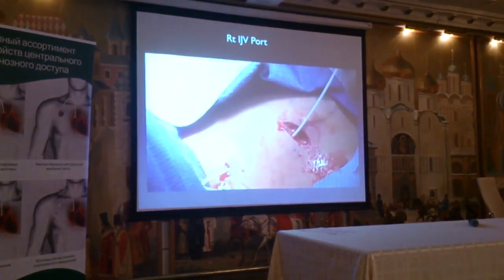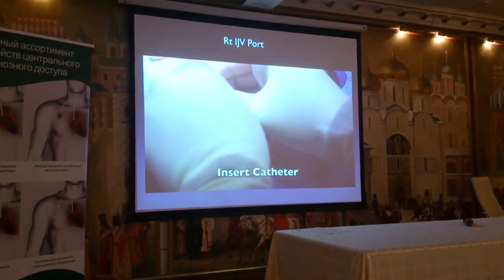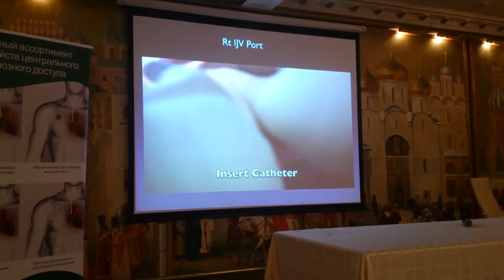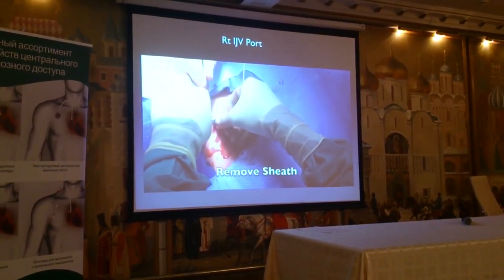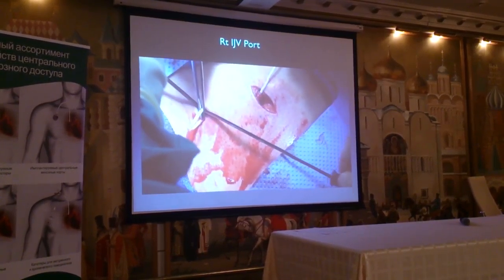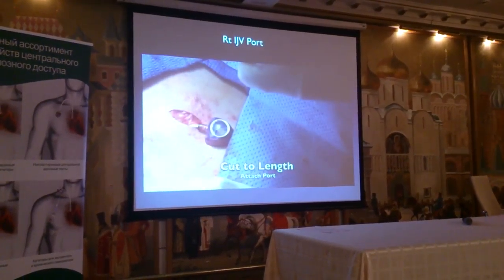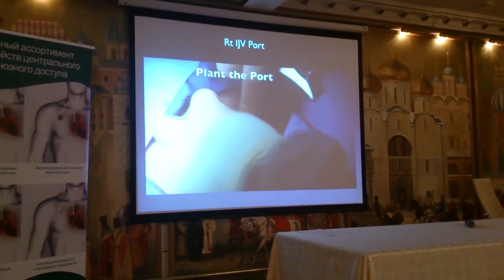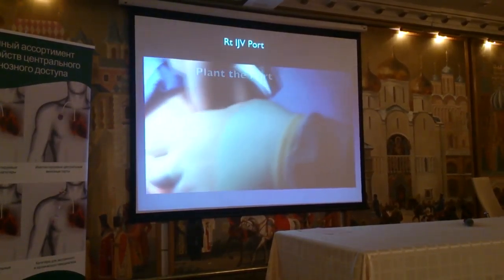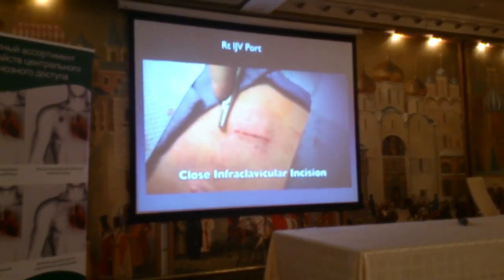Then we'll put in our introducer — all very standard. We'll place the catheter through the introducer, break it off, and attach the power port to the catheter. Then we'll put the port inside of the pocket and close everything up.